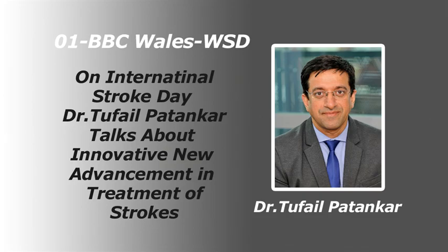Yeah, because we are mainly talking about ischemic stroke. So, if a blood vessel in the brain is blocked, then distal to the blockage, the brain is not going to get oxygen and it's going to die. So it's very important to open that blood vessel as soon as we can. What we do is get across that clot and then use a device. Either you can suck it or you can put a stent in it and then use a device to pull the clot. The idea is to do it as quickly as possible so that the flow is back to the brain, and the brain can get the oxygen.